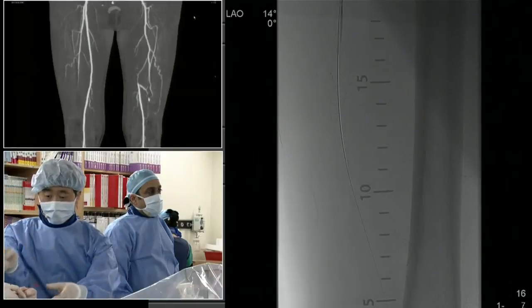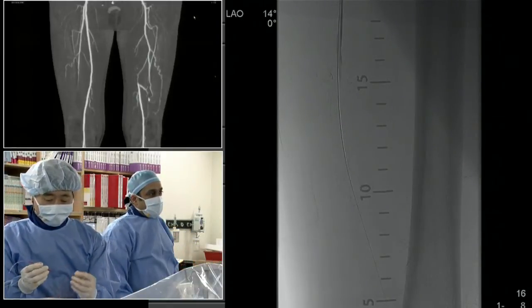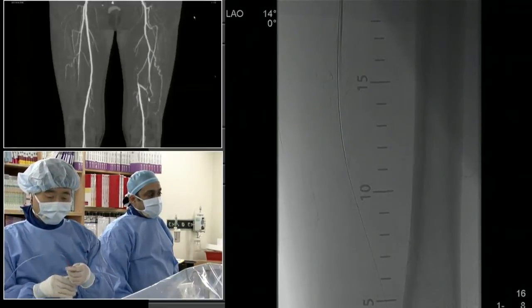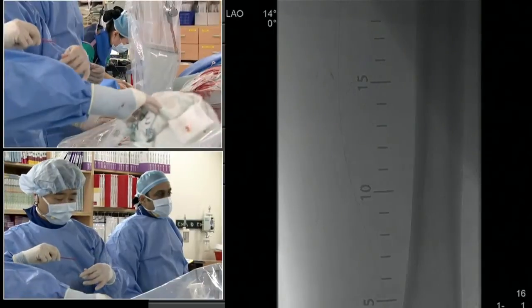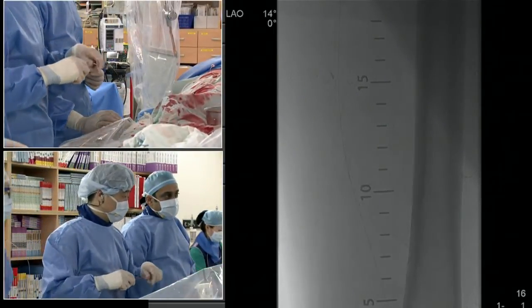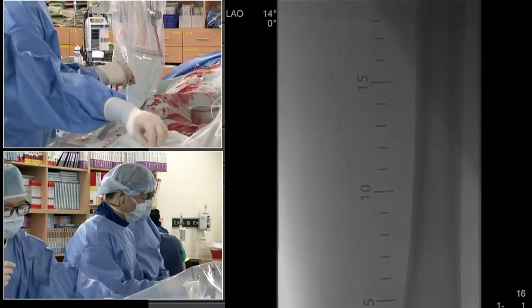I guess if it was available, I'd probably use it in this case all the time. Wouldn't you, Lawrence? Yeah. I think it's an attractive approach. And then again, it leaves the opportunity for restenosis to be failure, but with no endoprosthesis in place. Right. That's probably the biggest attraction, that nothing's left in there.